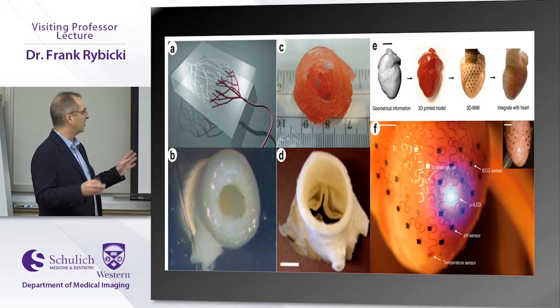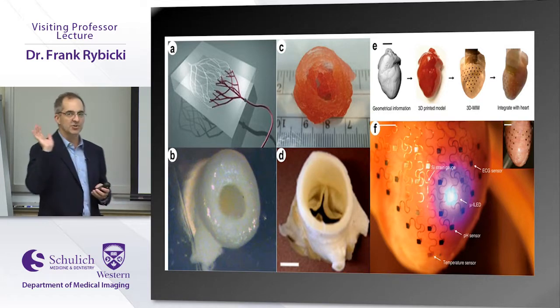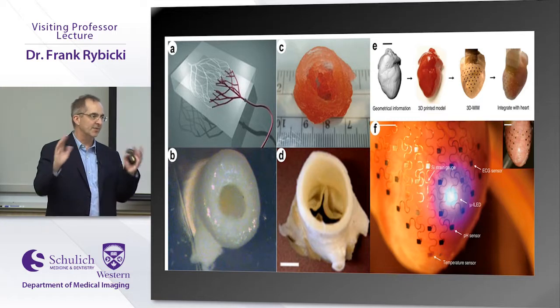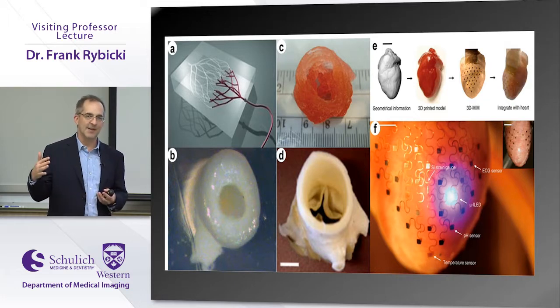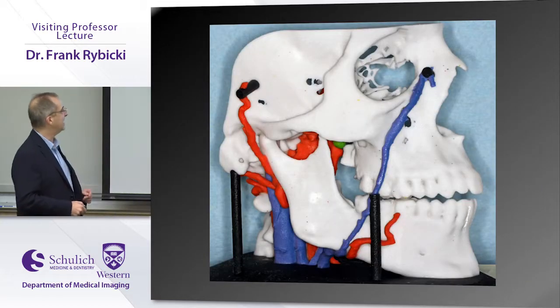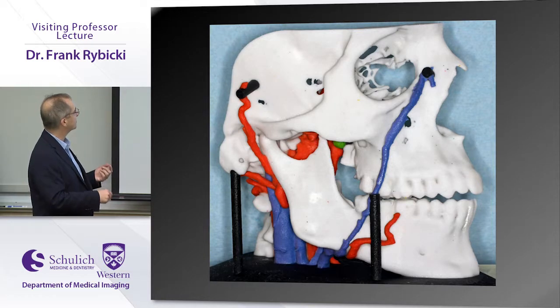I'm not going to get into the whole bioprinting thing, but you can start to think about printing the valves. You can print sensor devices and put them on the myocardium to determine when there's going to be an arrhythmia. And then you can print the actual device to correct the arrhythmia, and it perfectly fits on the myocardium. You can put sensor devices in stents. You can 3D print a stent with a sensor device to look at the hemodynamics and see a myocardial infarction before the infarction happens, because you can have a customized sensor within the coronary arteries. This is the picture that's on the RSNA website.